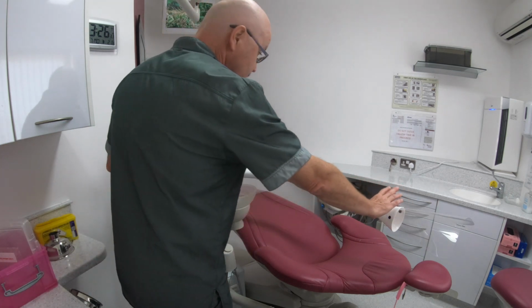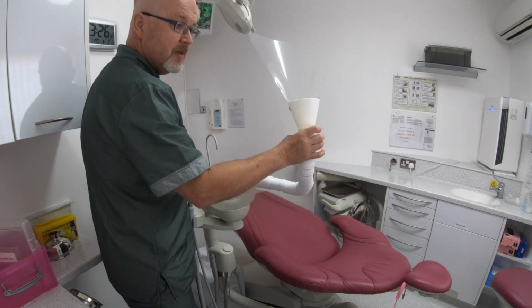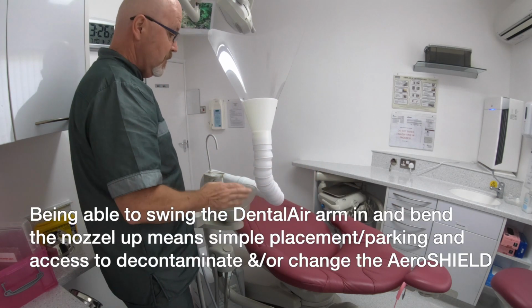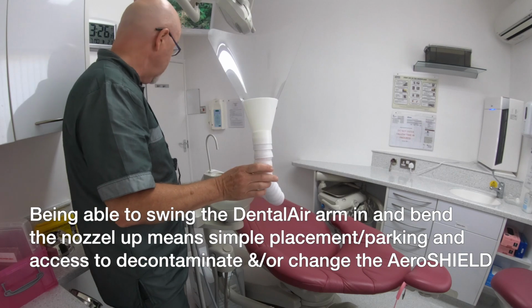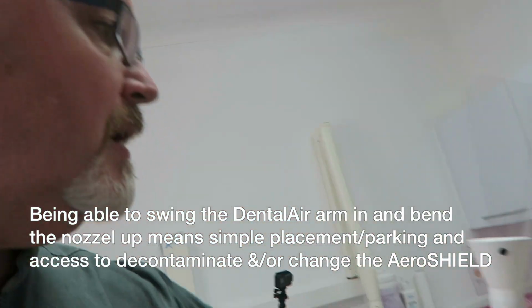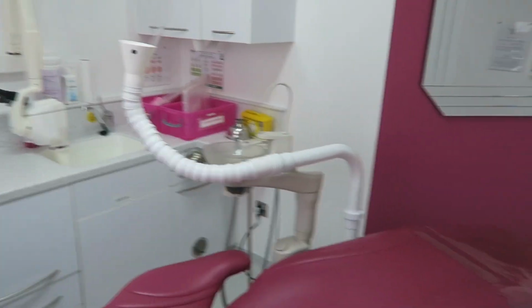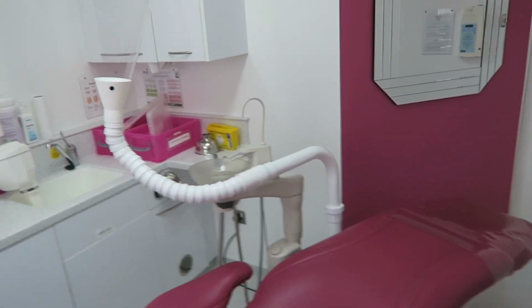We've got this Rigiflex arm which can be pulled across and then pulled up, so it's out of the way. Most of the spittoons at the moment are going to be out of use. This is going to be very practical in here, and that's really quite a compact placement there.